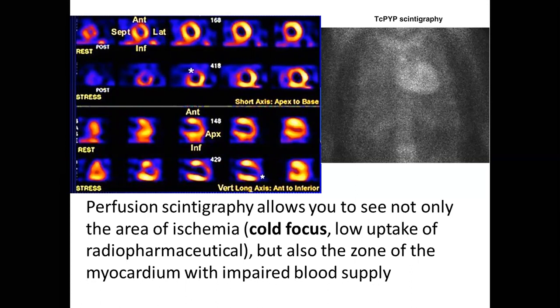So let's speak about perfusion scintigraphy. It is very important when we want to see myocardial infarction or ischemia at very early stages. It is also used in tandem with coronarography, CT scan, and PET CT, either or some of them. So check this out.